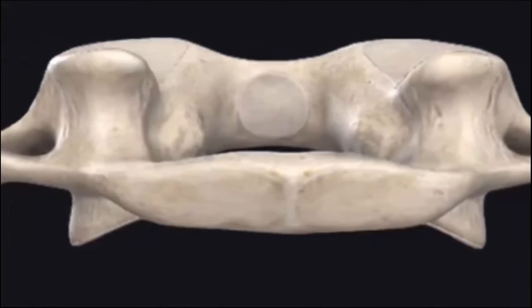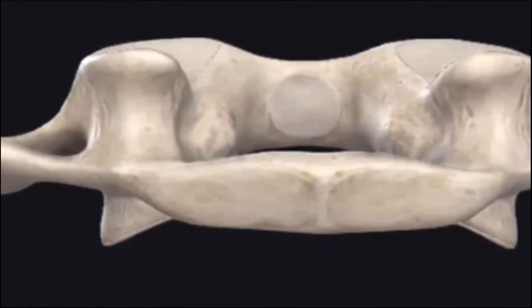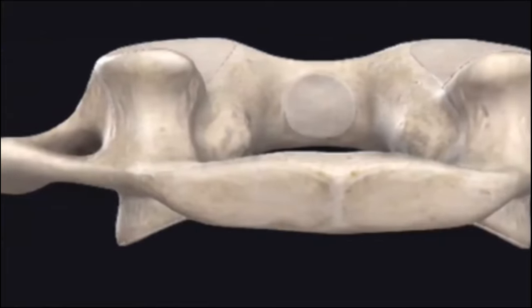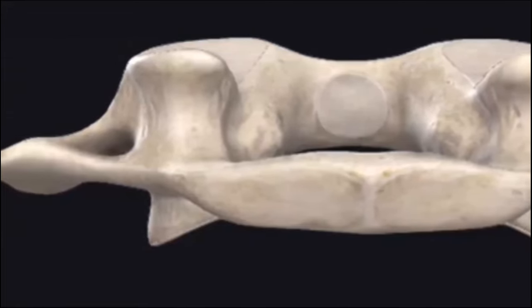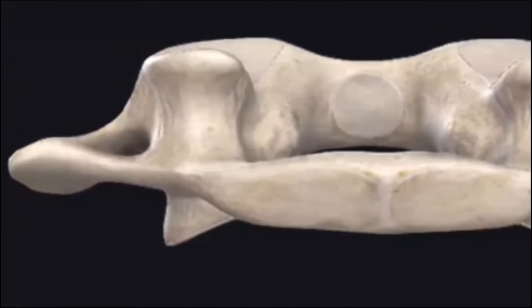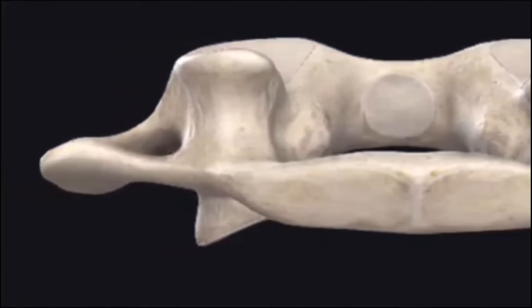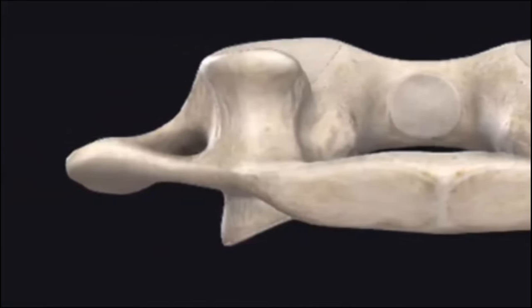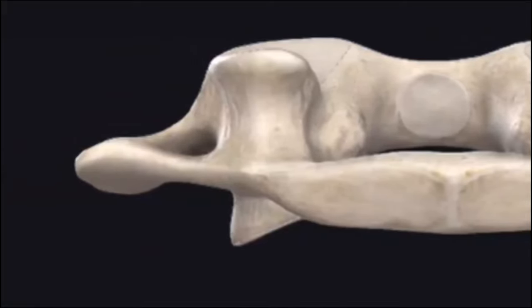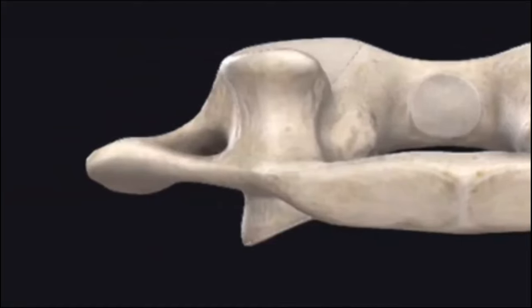The inferior edge of the posterior arch of the atlas may be drilled to expose the lateral mass of atlas, especially when this is occipitalized and there is condylar hypoplasia. This may also be very useful if ganglion preserving C1, C2 facet joint surgery is being performed, in which the screw placement above the C2 ganglion is facilitated by the complete exposure of the C1 lateral mass by the drilling of the posterior arch of C1.